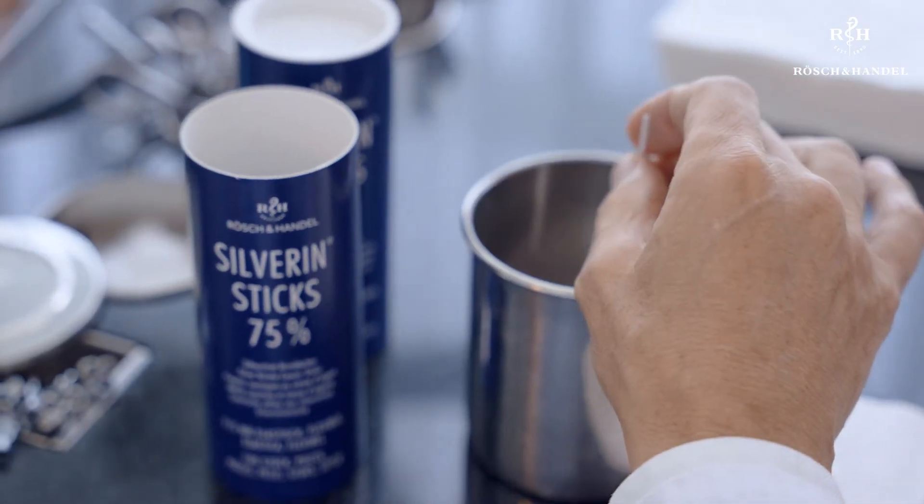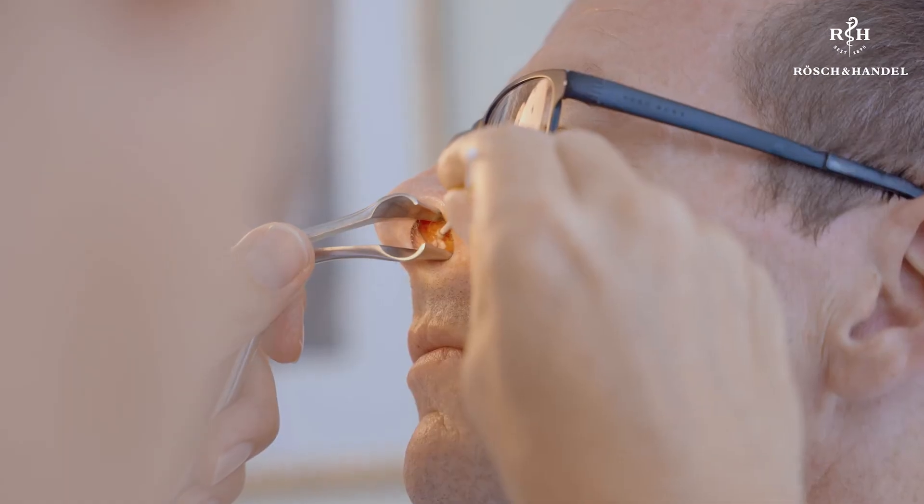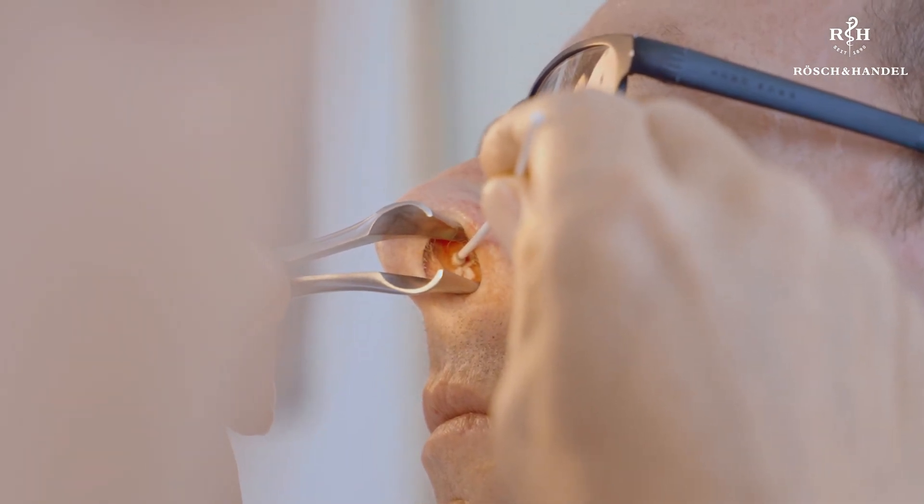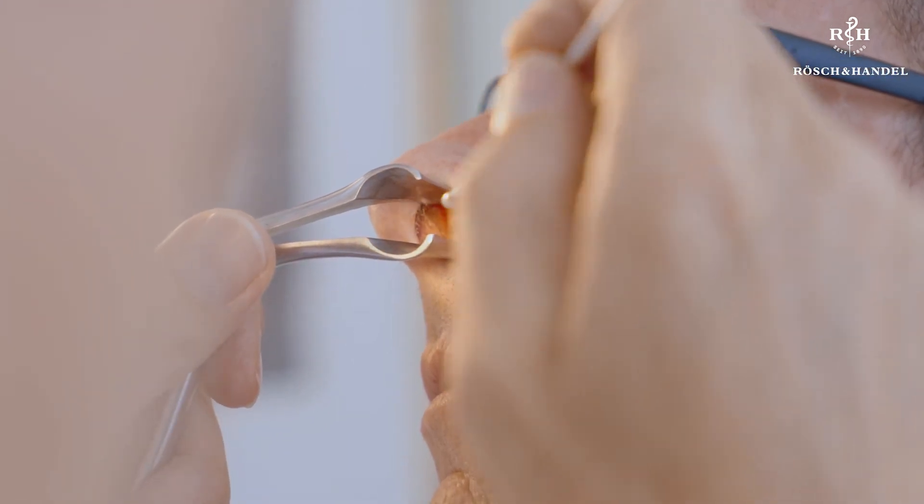After the cotton wool has been removed, the stick is briefly dipped in water to moisten the tip. Water is important because saline solutions may absorb the silver nitrate and thus compromise its action. The water droplet that remains on the tip must be wiped away. After that, the stick is applied at the precise site of the vessel using gentle pressure. The stick is left in contact with the mucosa for about three seconds and then removed with a slightly rolling motion. I use it at three different points, doing it exactly the same at each point. Excess caustic material, which would otherwise be transported posteriorly via the mucus membranes, can be simply but carefully wiped away using a cotton swab.